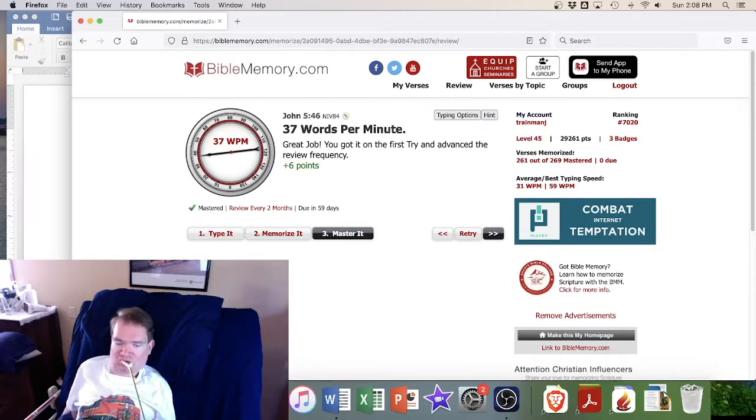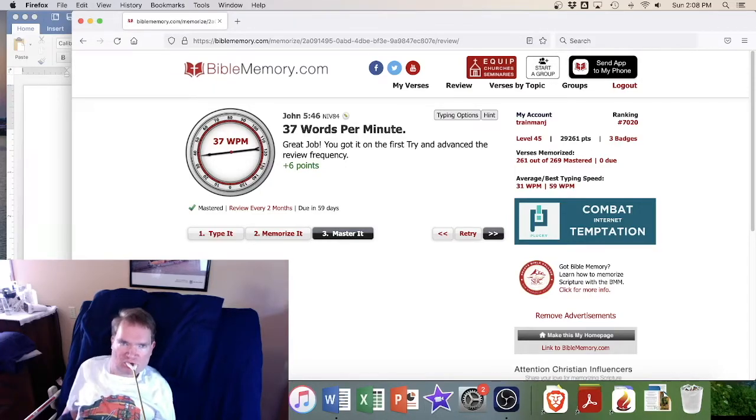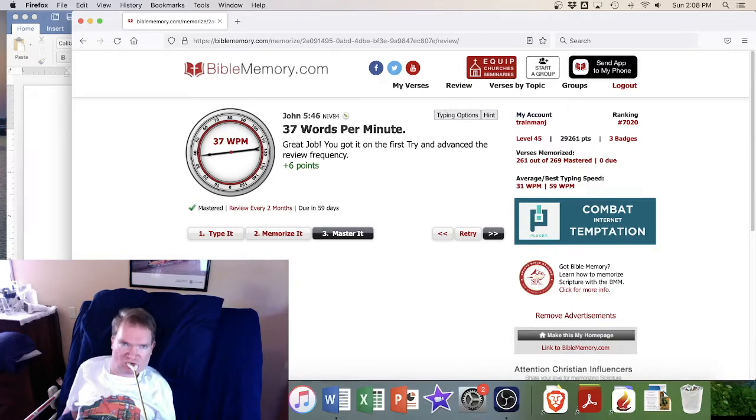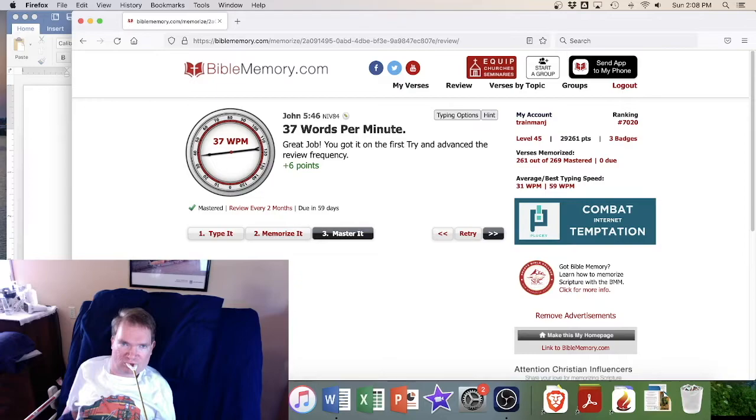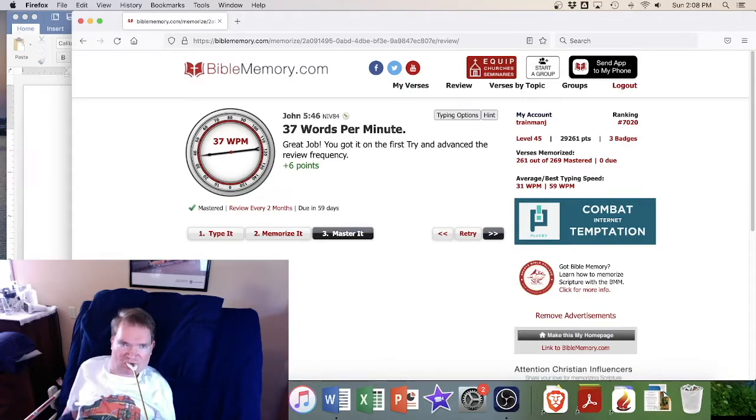The main thing of course is typing on the computer here. As you just saw, I typed that verse John 5 verse 46 and I got 37 words per minute.